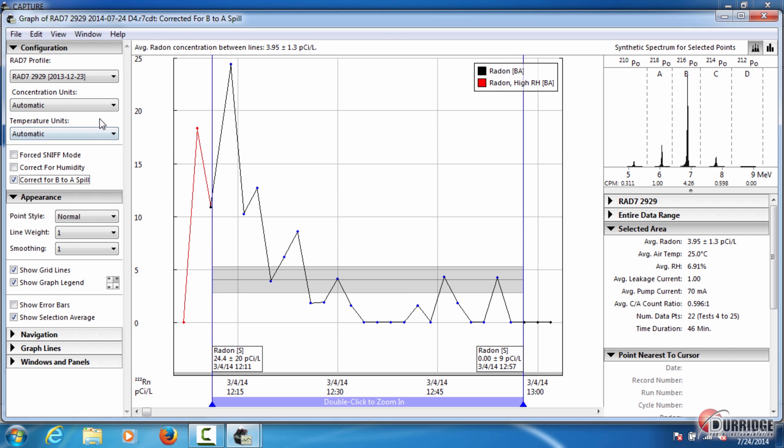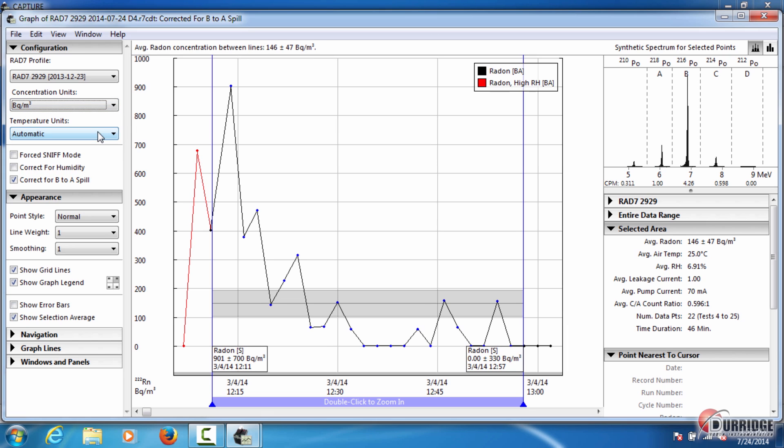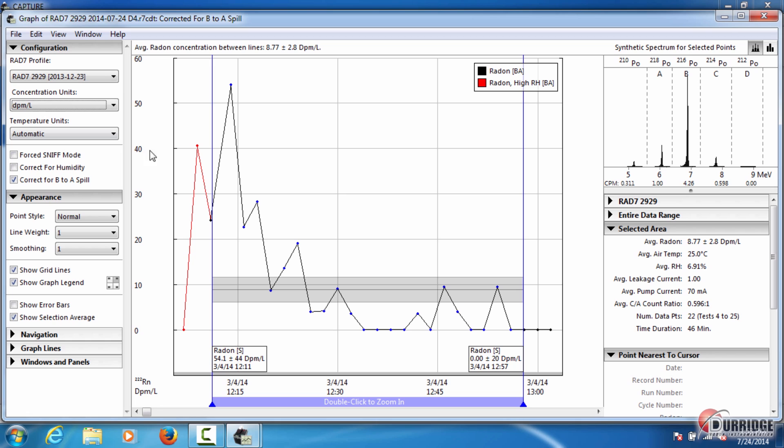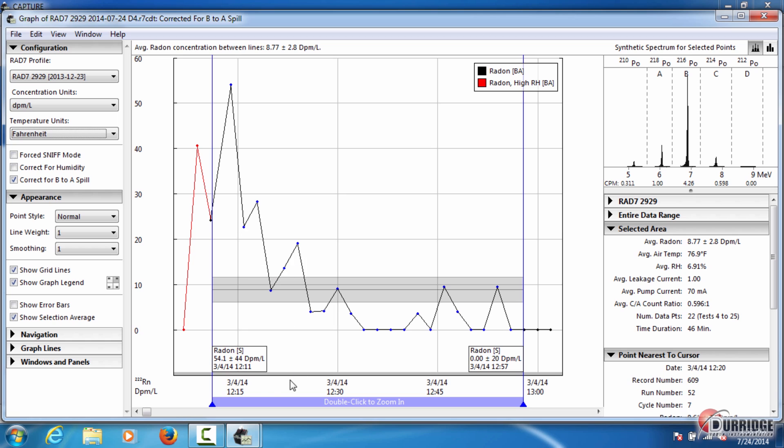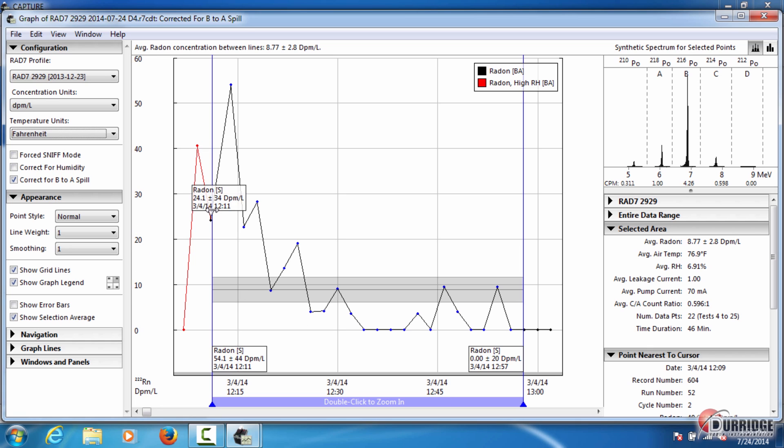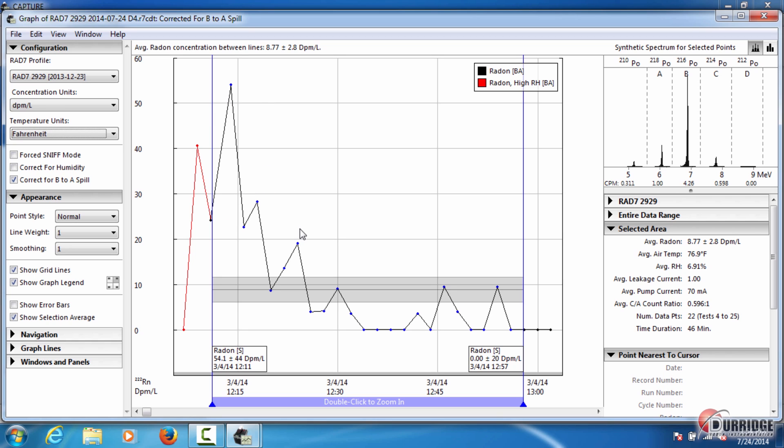Above the correction boxes are menus which let you change the concentration units, which modifies the y-axis scale here, and temperature units, so you can select Fahrenheit or Celsius based on your preference. On the graph, you can see that the x-axis represents time. See the timestamp values here, while the y-axis shows the Radon concentration. So the graph shows a line of the change of Radon concentration over time.